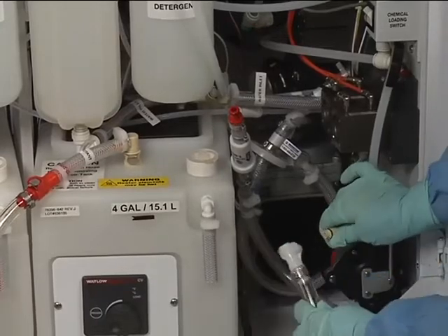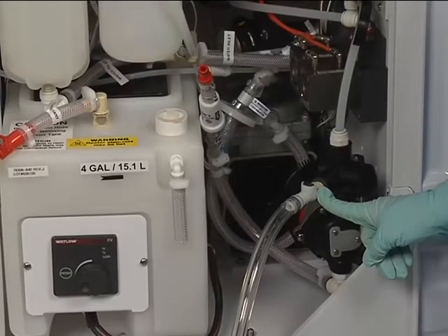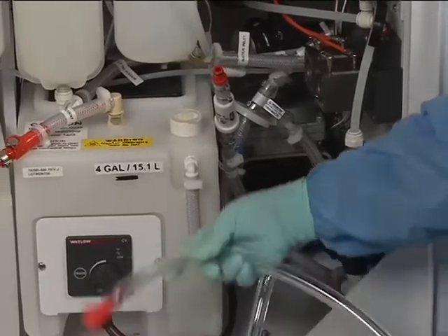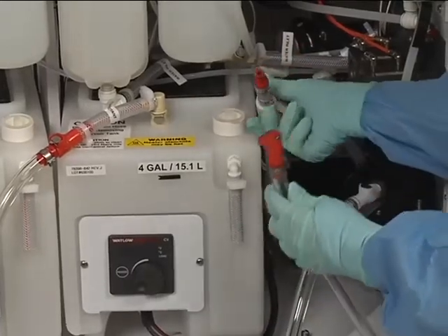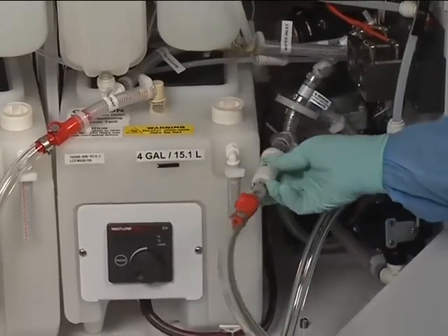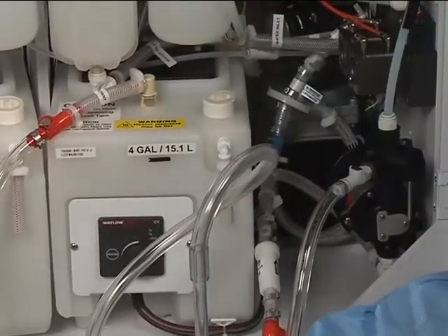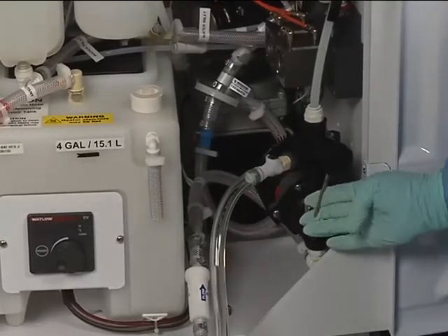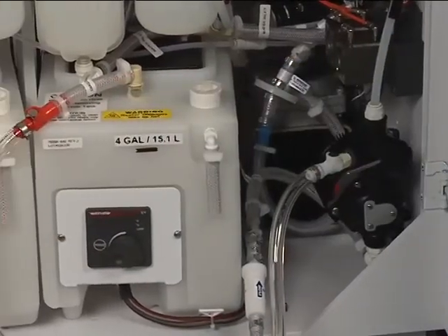Connect the cream-colored female end of the transfer pump tubing segment to the cream-colored male end of the three-way valve located on the transfer pump. Locate the transfer pump tubing segment with the red female end and the long rigid end with rubber seal. Connect the red female end to the male red-colored end of the disinfectant filter. On earlier models, the male end of the disinfectant filter may be cream-colored. Place the rigid end with rubber seal of the transfer pump tubing into a full disinfectant container. Rotate the three-way valve handle until it points out from the side wall of the DSD cabinet, indicating the direction that fluid will flow into the reservoir.